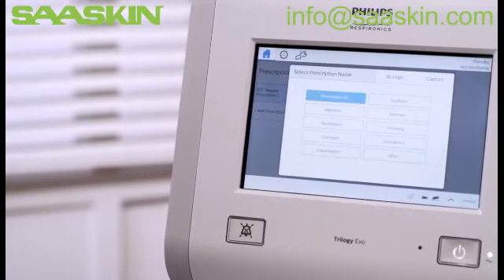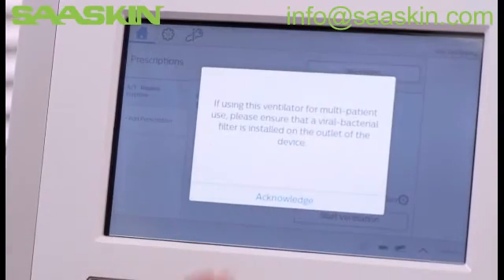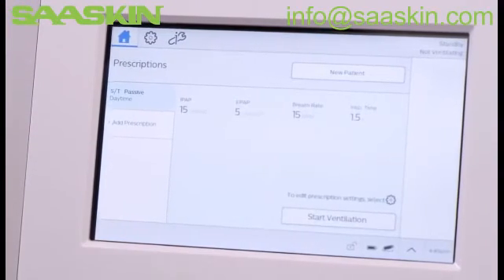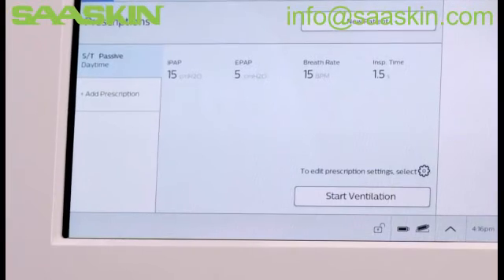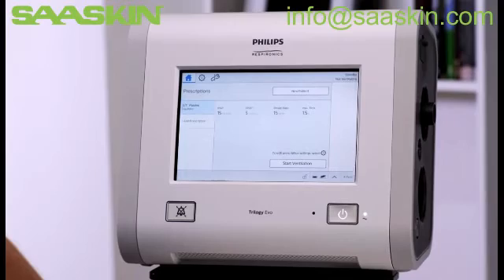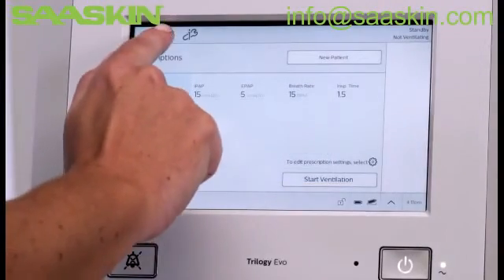Choose your preferred prescription name from the table and tap Accept. Read and acknowledge the statement. If the appropriate patient circuit is attached and you want to ventilate with the pre-programmed settings, you can begin therapy by selecting Start Ventilation. If you need to edit the prescription before initiating ventilation, tap the Settings icon.